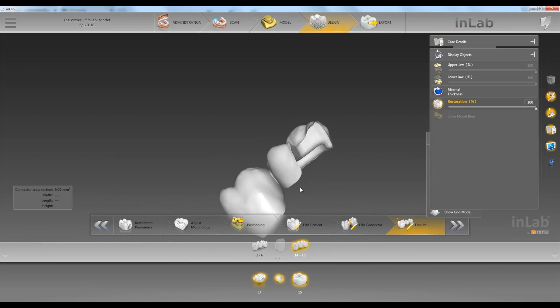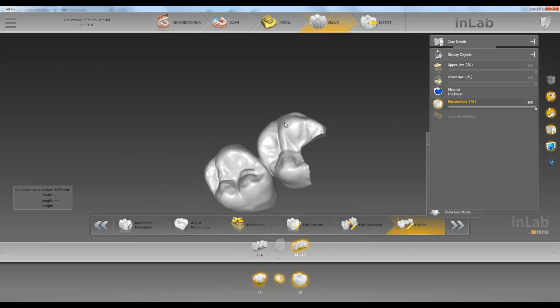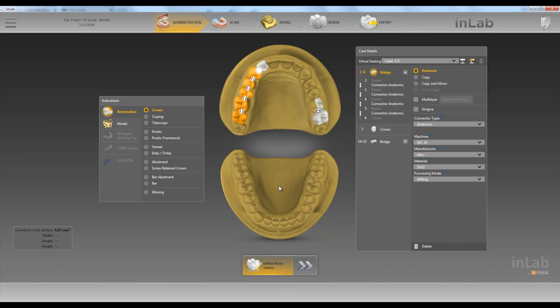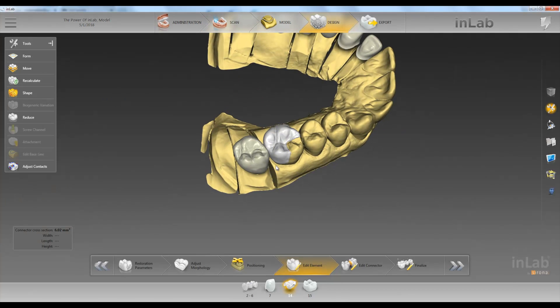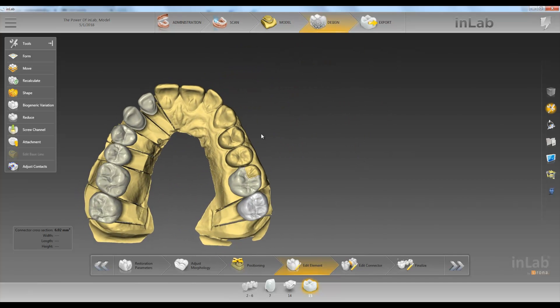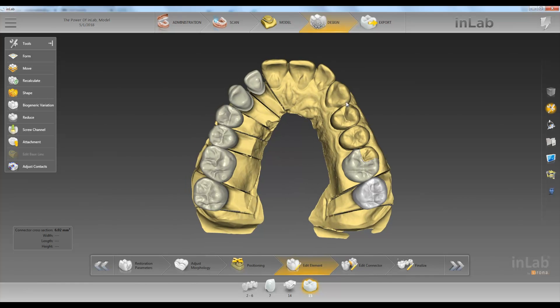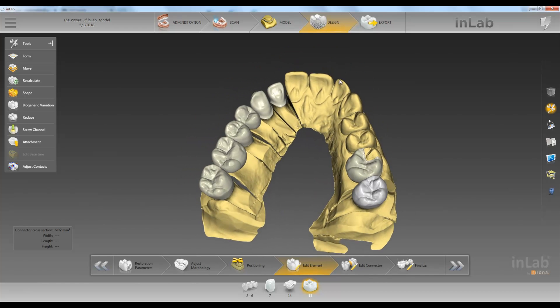So now we have a splint. If you change your mind again and want it to be two singles, go back to administration, change it back to two singles, go back to design, and now we have two singles again. It doesn't affect our design — we don't have to recalculate anything; it just changes the type of connector that we have.